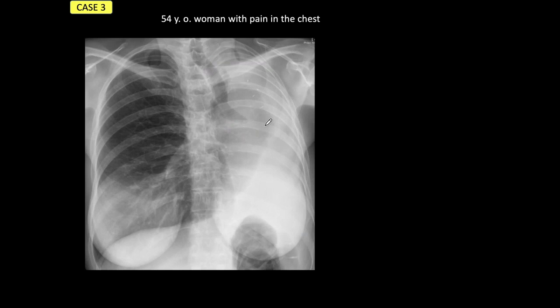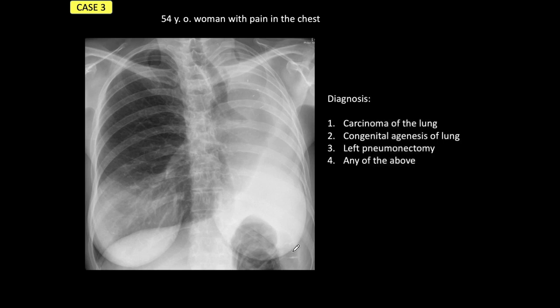Case number three: a 54-year-old woman with pain in the chest. The lung is obviously abnormal — there is a white hemithorax. I'm going to give you four possible diagnoses: carcinoma of the lung, congenital agenesis, left pneumonectomy, or if you cannot make up your mind, any of the above. Always ask yourself: is the abnormality significant?